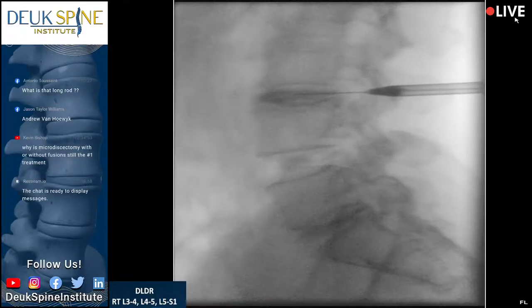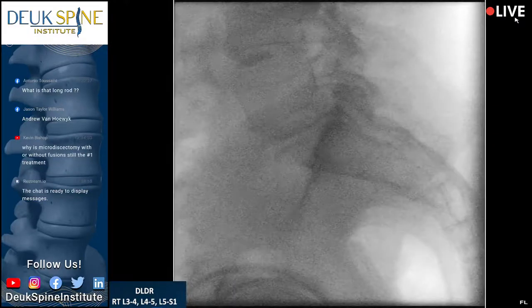Why are you doing orbit? I didn't ask you to do orbit. It's WAG, Monica. WAG is what lines up the pedicles, not orbit. No, you didn't do it enough, Monica. That's why.